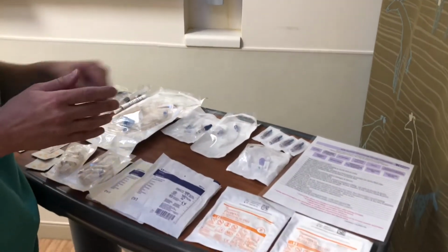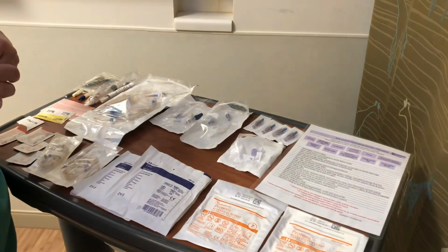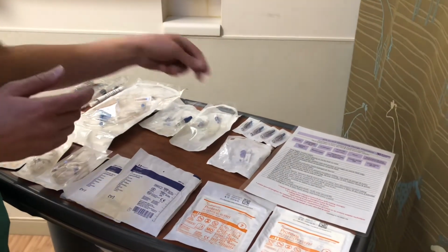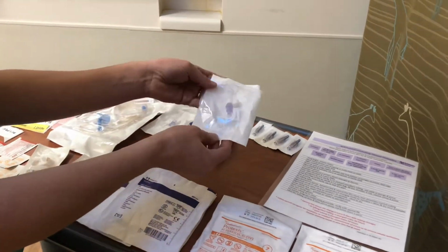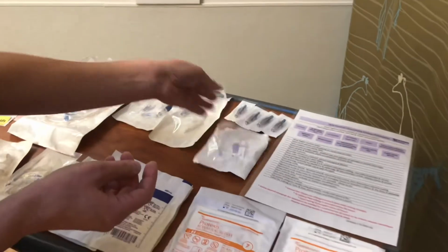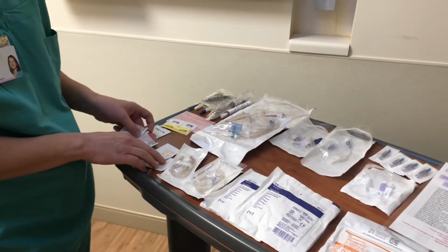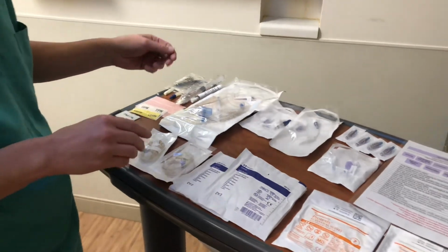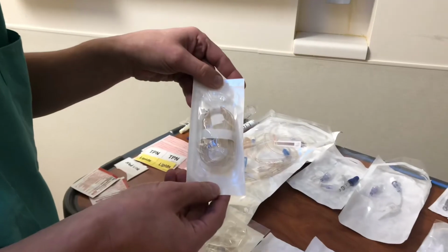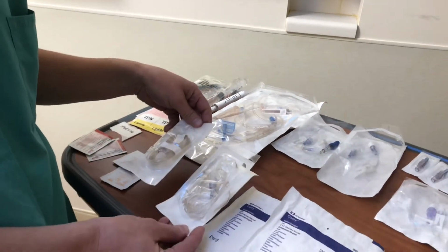Next up, you're going to have your claves, and I have 4 of them for a standard tubing change that would be like TPN lipids with an inline medication line. Then we're going to have our bifuse, or we can also refer to this as our Y port. We're going to have some betadine wipes, alcohol wipes, and then your medication microbore tubing as needed.